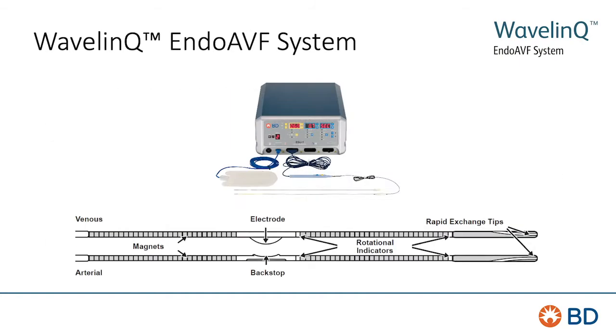So the WavelinQ EndoAVF system: 2 rapid exchange catheters, 4 French compatible sheaths. I prefer a 5-4 Terumo Slender sheath to allow for the device and the 014 wire to be alongside the device. Several magnets with a rotational indicator, both on the end and near the money part of the device, so to speak. The money part of the device, where the business happens, is between the electrode and the backstop. The backstop is inside the patient's artery. The electrode is inside the vein.